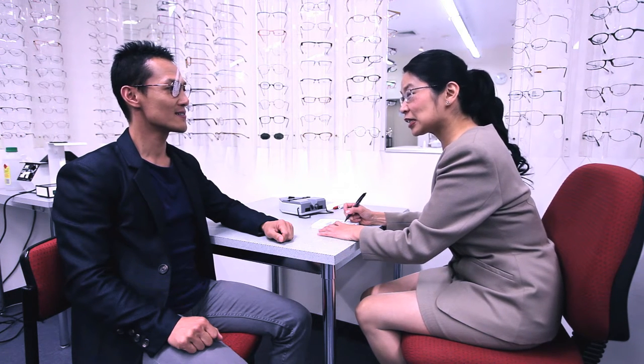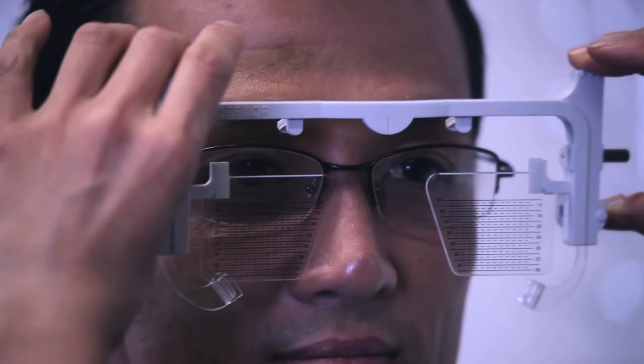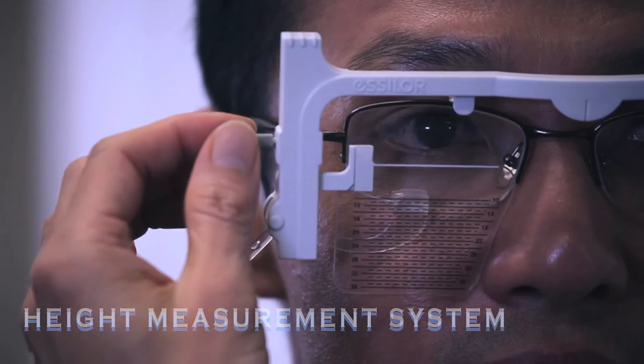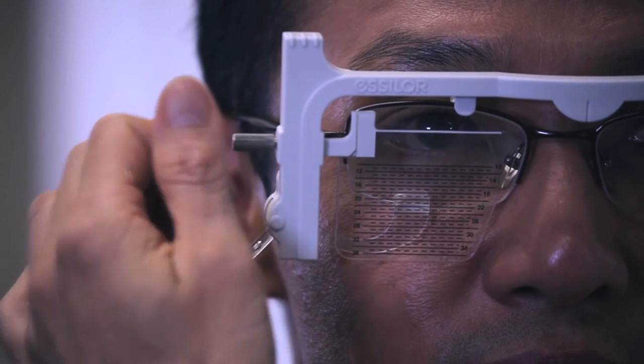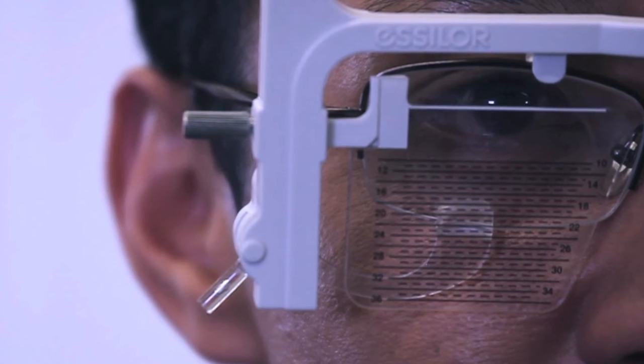The dispenser engages the client in conversation whilst assessing the heights. A third method involves a gauge called the height measurement system. This gauge clips onto the frame and the scales can be wound up and down until the top of the scale is in line with the reference point — which, in the case of progressives, is the center of the pupil.